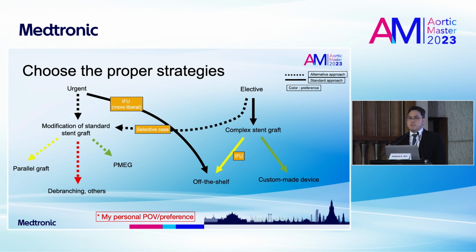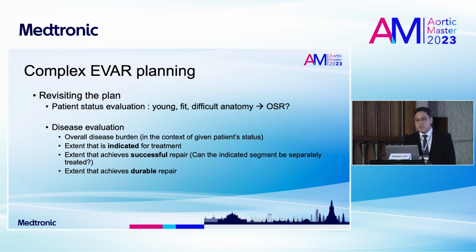And I think one of the most important things is to choose the right strategy, a strategy that is proper not only to the patient, but also to your facilities and the experience that you have. For me, I will start with the custom-made device. I will then follow with the off-the-shelf, and then other relatively less common procedures like PMEGs or parallel grafts.